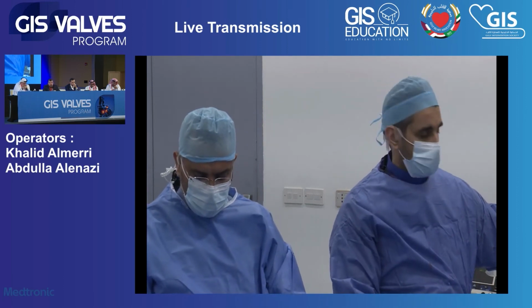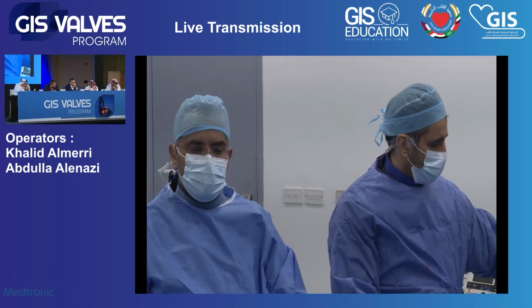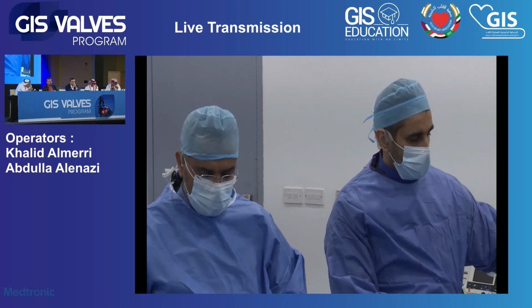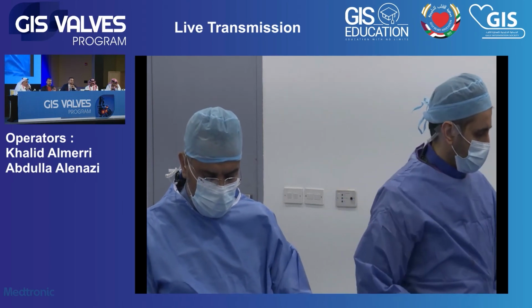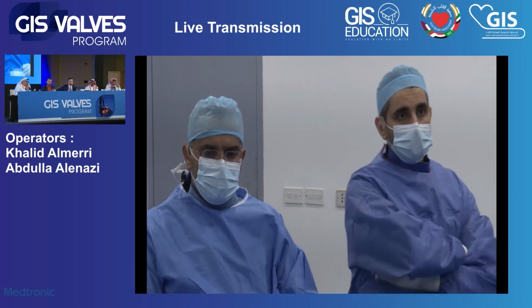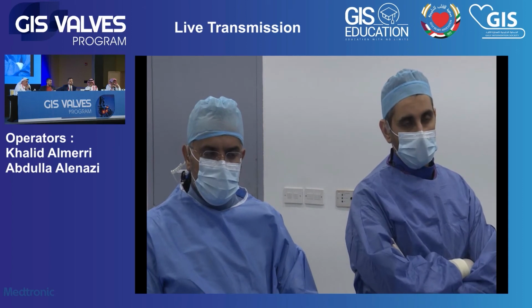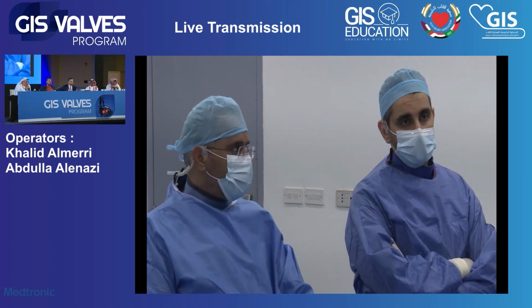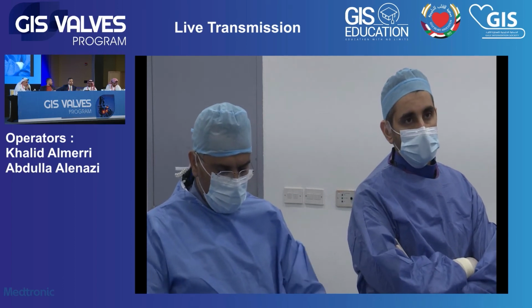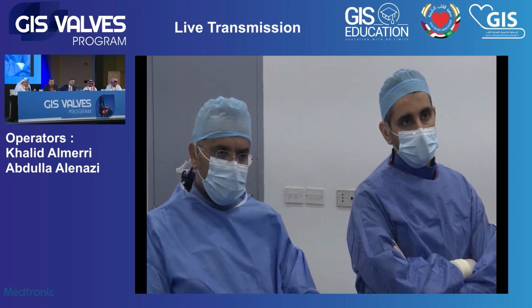Right. This patient is on heparin now. Has she interrupted her warfarin or not? Yes, she's on heparin for the procedure, right? I think she was already anticoagulated. Did you add any more heparin? Khalid, the question from Dr. Abdurrahman: was the warfarin or anticoagulation interrupted to start heparin for this procedure or not? Did you interrupt the anticoagulation? No, according to my knowledge. Did you add any heparin extra for ACT control?